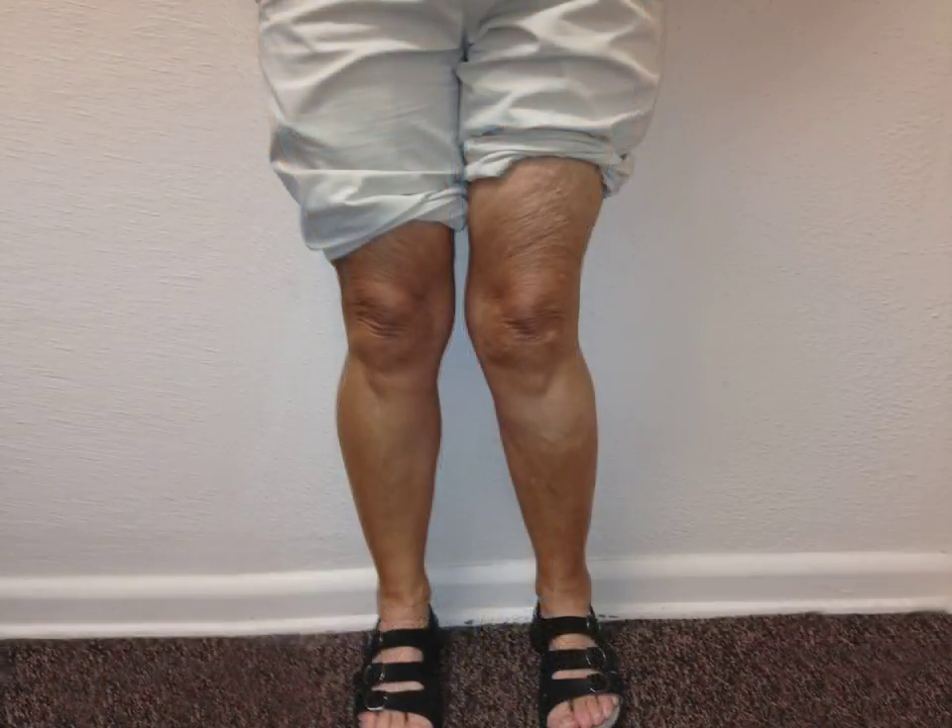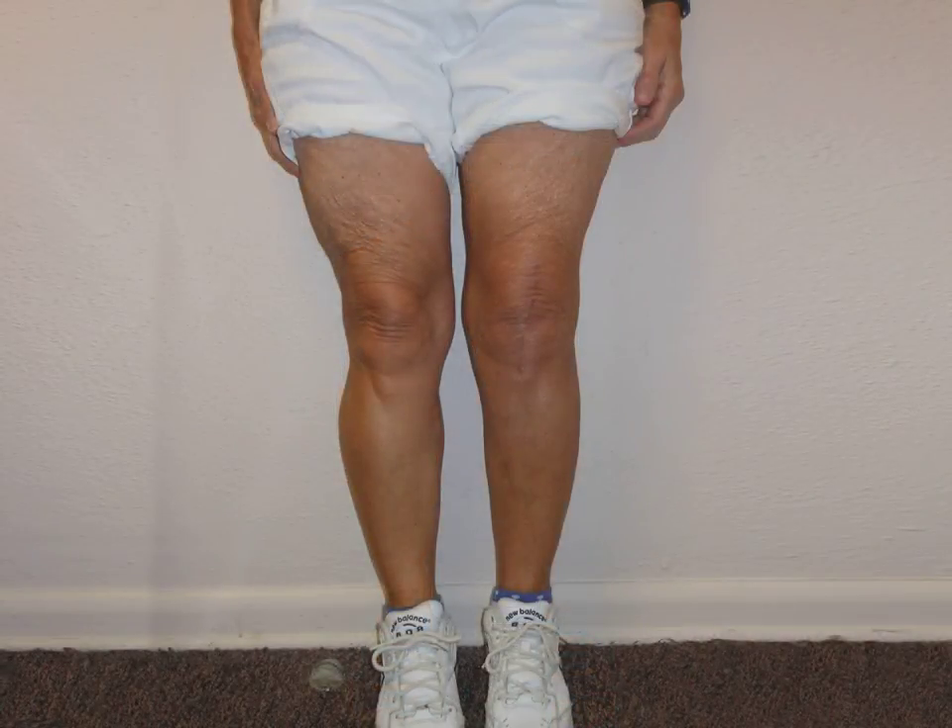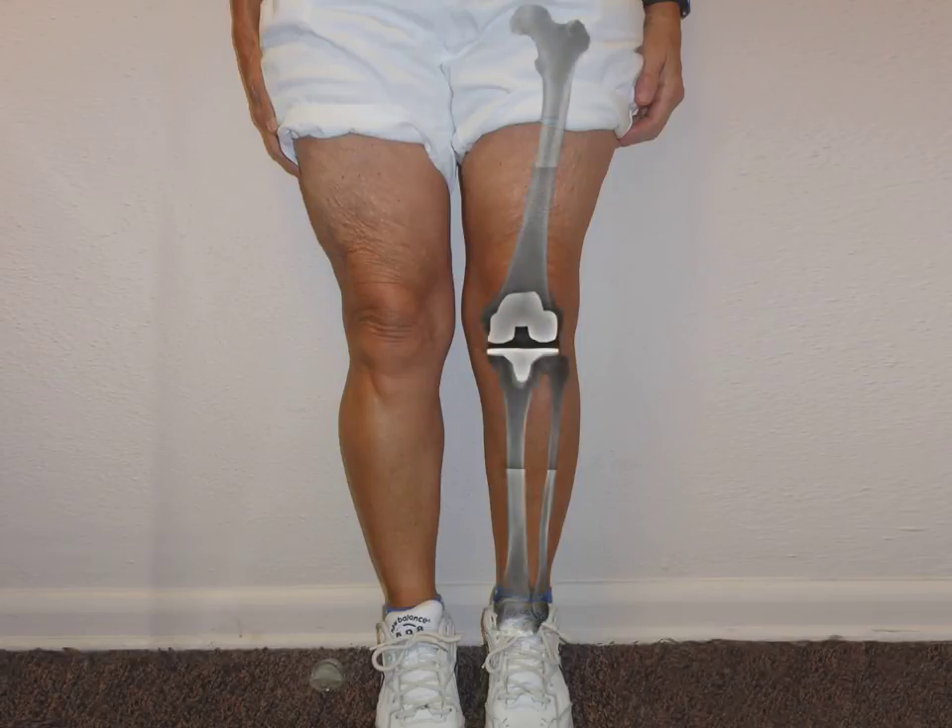Let's review her pre-operative picture once again. The difference between the before and after is dramatic. Looking at Mary's full-length post-operative x-ray laid on top of her leg, her knee now sits in a straight line drawn from her hip to her ankle.